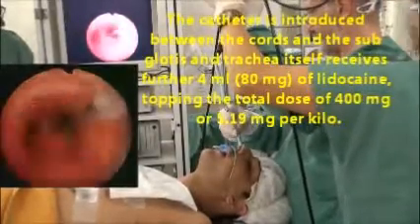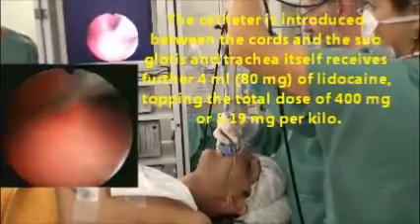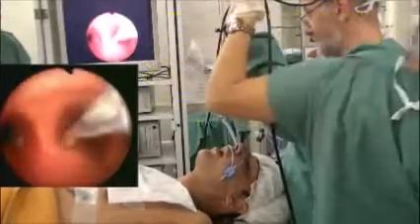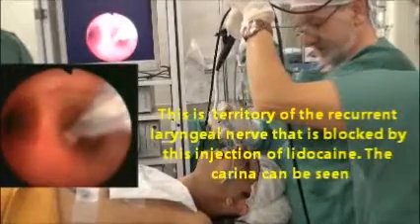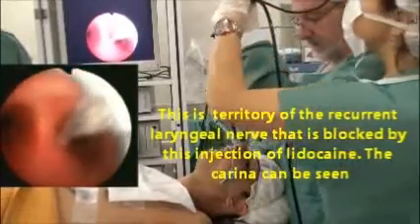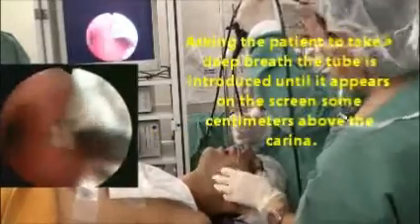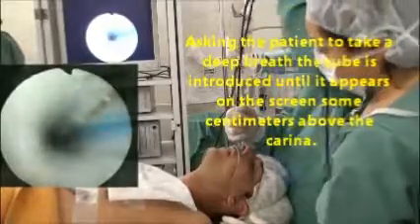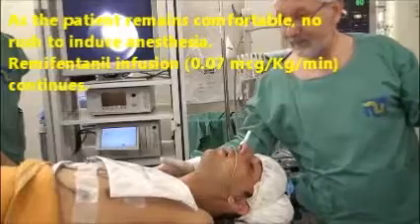Now we are going to administer lidocaine with the catheter below the vocal cords in order to increase the acceptance of the tube. In spite of the inadvertent touch of the carina with the epidural catheter, there was no cough reaction of the patient. With the carina in sight, the tube is introduced into the trachea using the scope as a rail.